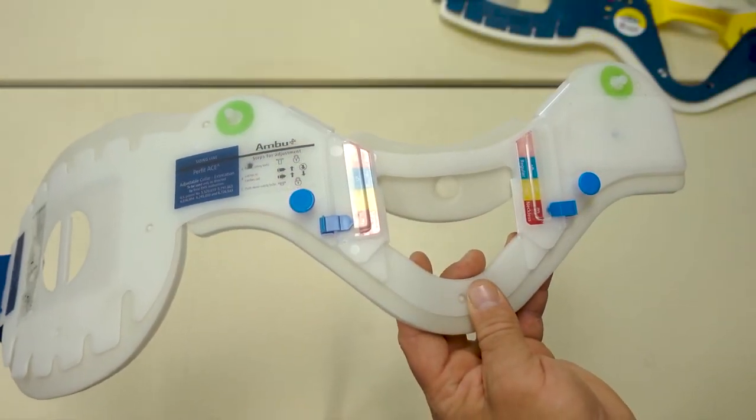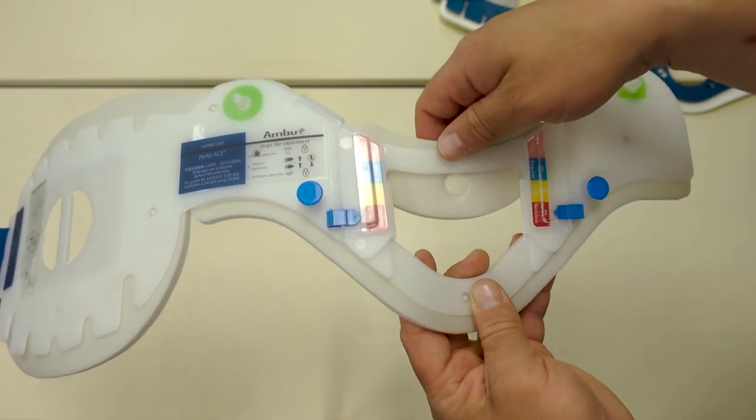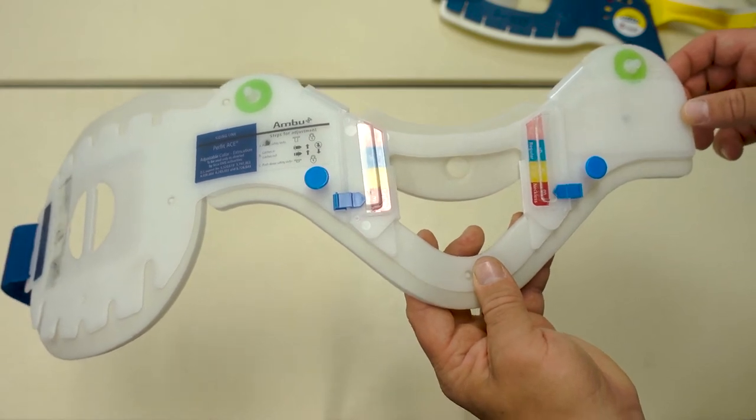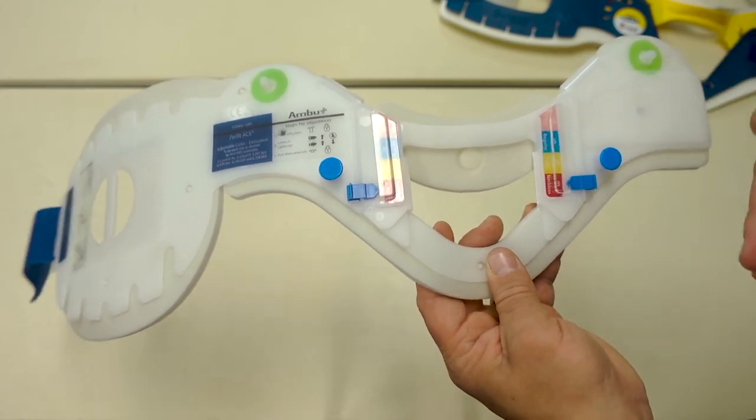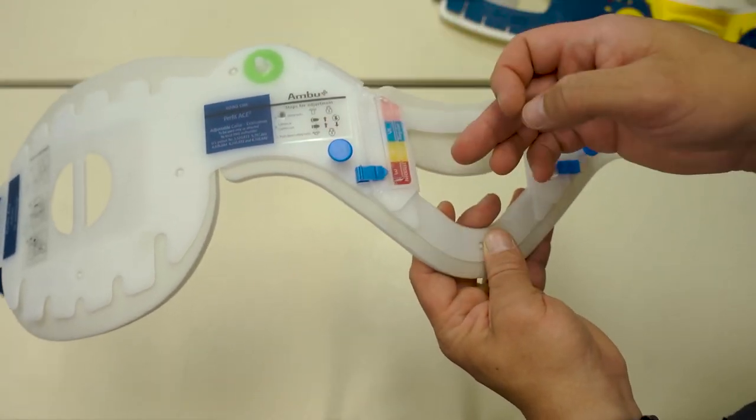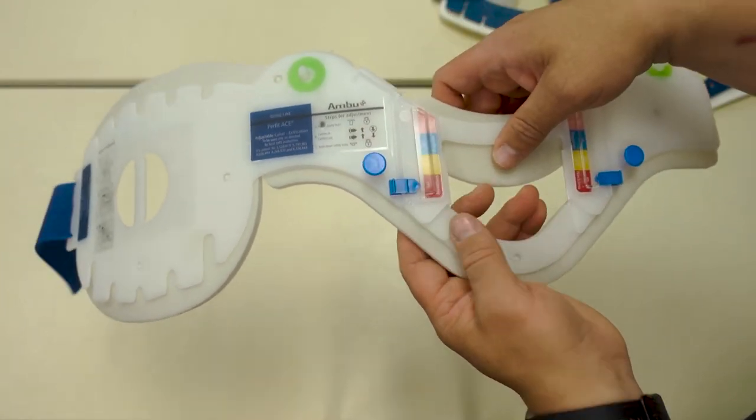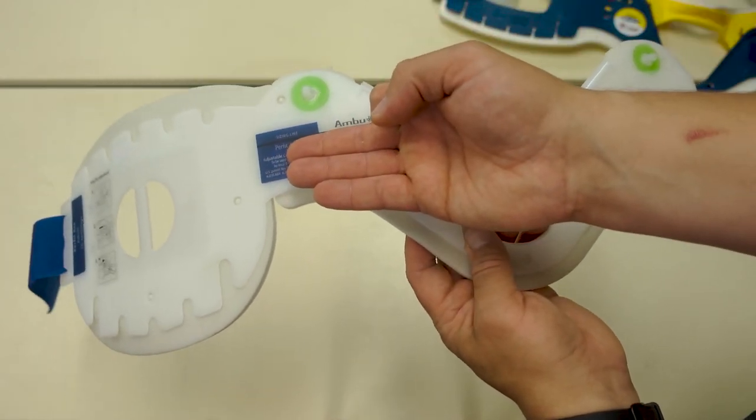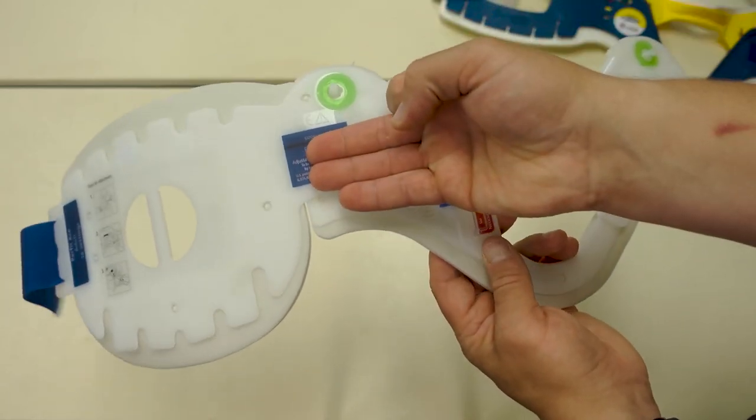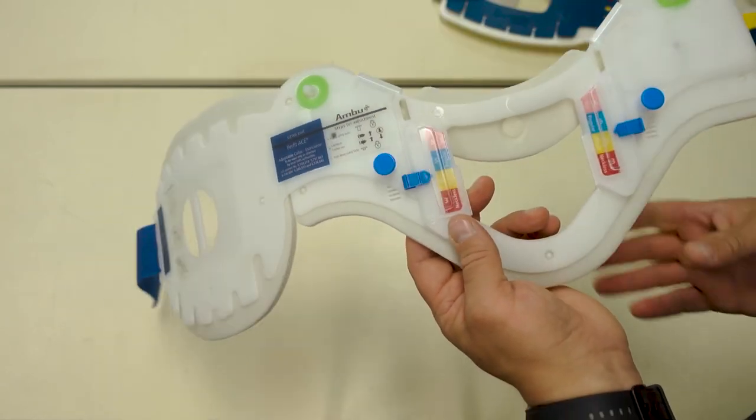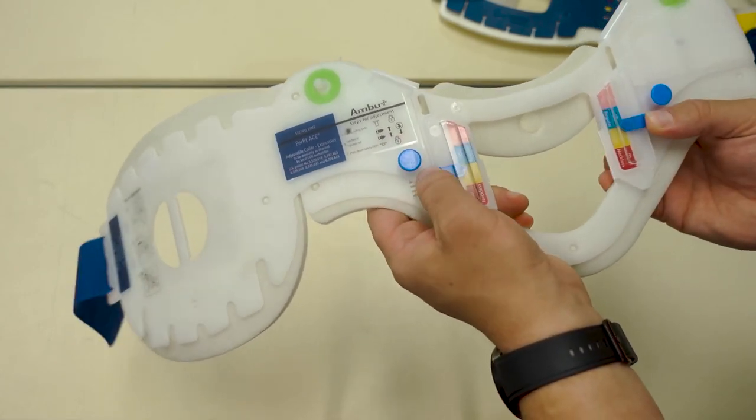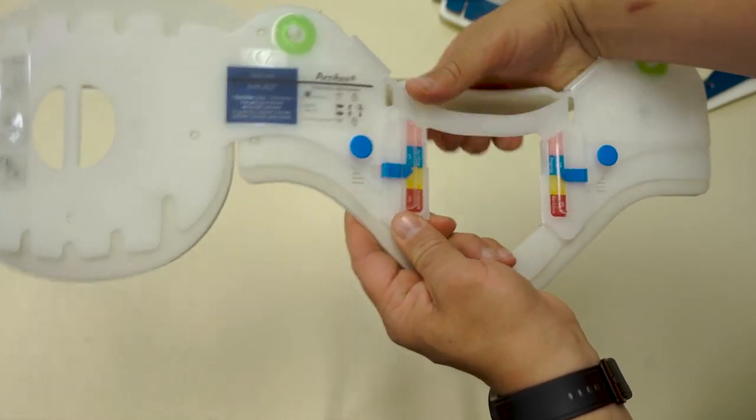The first thing you'll notice about the Ambu Perfit is that the chin piece is folded back and that there are four locks instead of two. To adjust the Ambu Perfit, take the measurement from your patient and measure from the sizing line down to the hard plastic edge. Adjust to the indicated size. Once adjusted, ensure that all four locks are applied and fold out the chin piece.